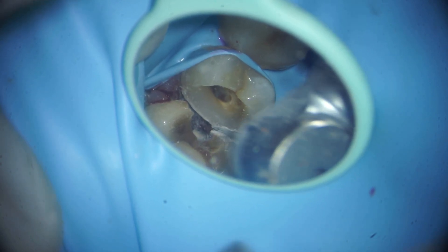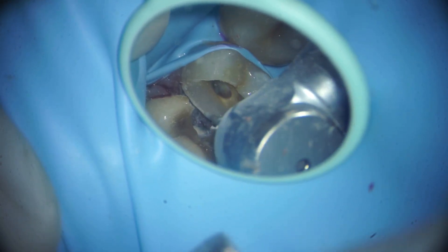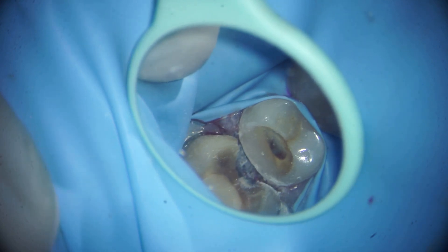We are finishing it with a red band bur. The most important advantage will be that while doing the root canal, we will not be spilling hypochlorite. The second advantage is that while doing the post-operative restoration, our matrix band will go very nicely below the elevated margin.